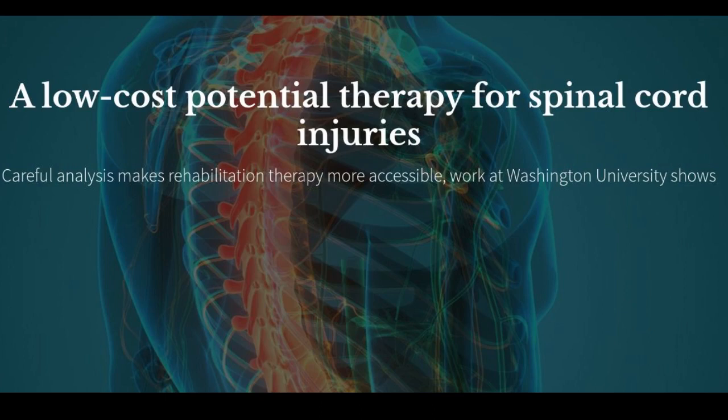The group tested a variety of electrode setups, and through repeated testing, they calculated a probability chart that pinpoints the best spots along the spine to place electrodes and the chances of activating specific muscles electrodes will have. Using that experimentation, Sianes created a map of the spinal cord that illustrates where along the body, in a hypothetical rehabilitation scenario, medical professionals should target to stimulate specific muscle groups.